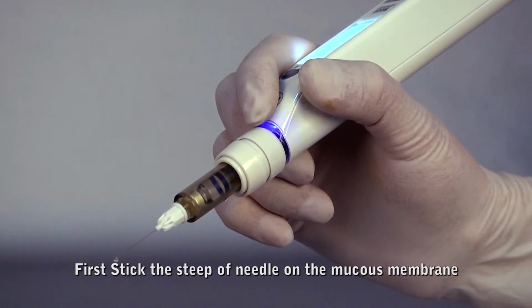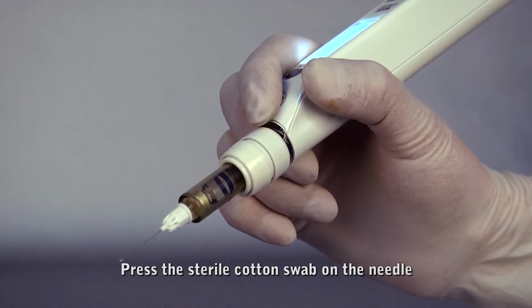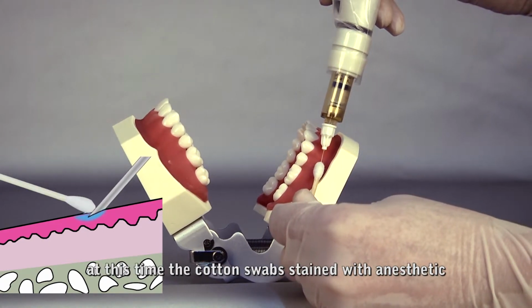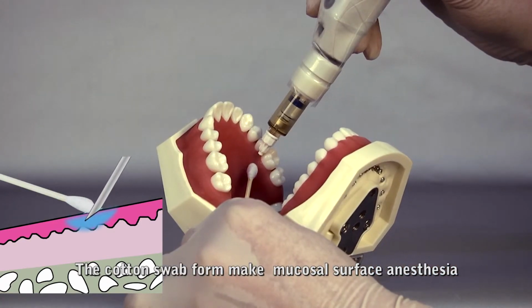First, stick the tip of the needle on the mucous membrane. Press the sterile cotton swab on the needle. Push anesthetic for about 4 seconds at low speed. At this time, the cotton swab is soaked with anesthetic. The cotton swab produces mucosal surface anesthesia.